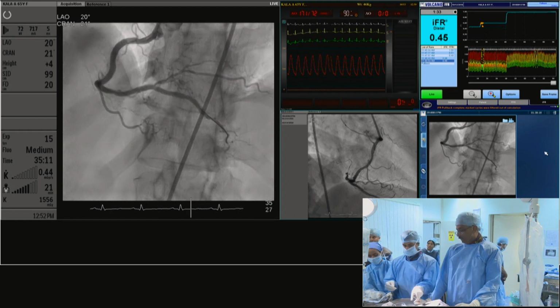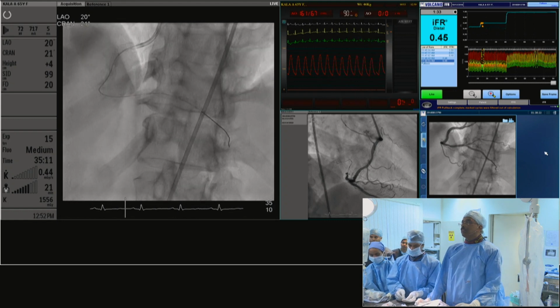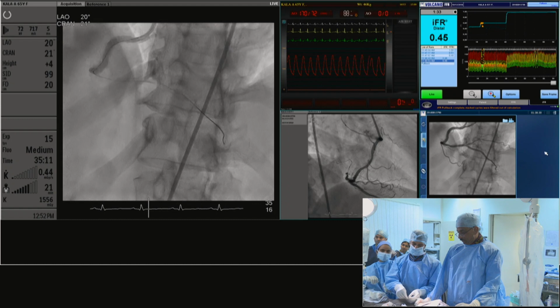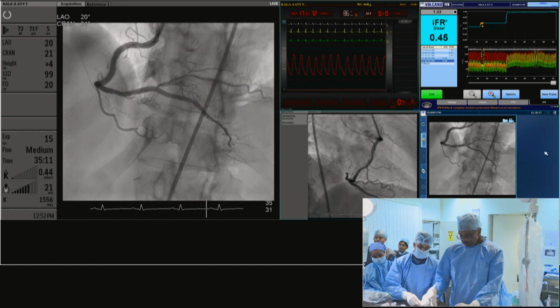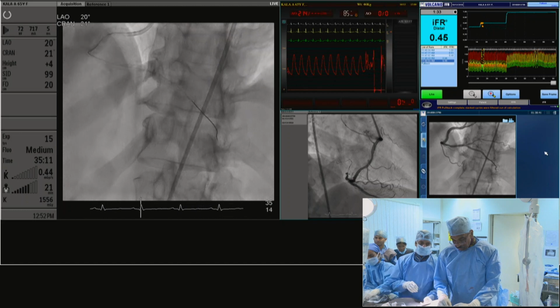There's the buddy wire which had actually been used. There could be a guide liner which could have crossed that proximal area to deliver a stent, and it would be a shorter stent delivered for that discrete critical lesion before the bifurcation. Having done that, my job as far as this patient is concerned would have been completed. I would have left the mid lesion untouched.